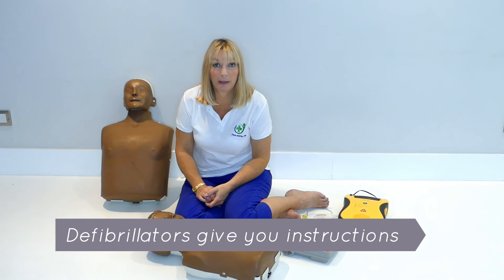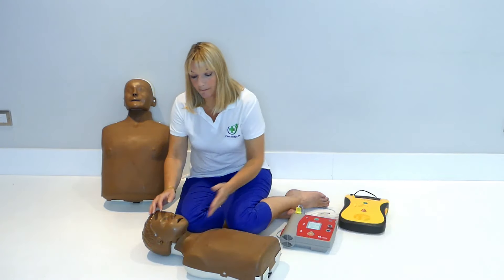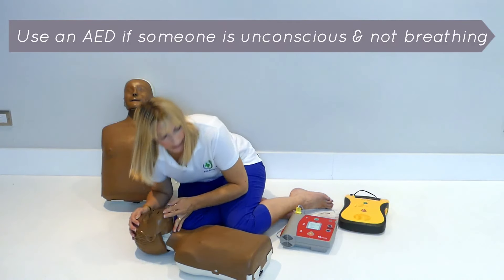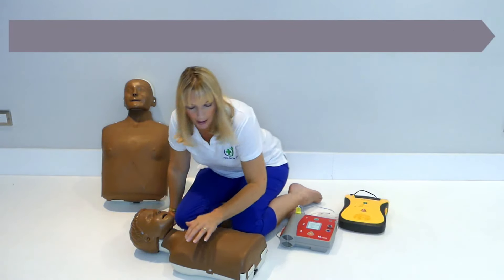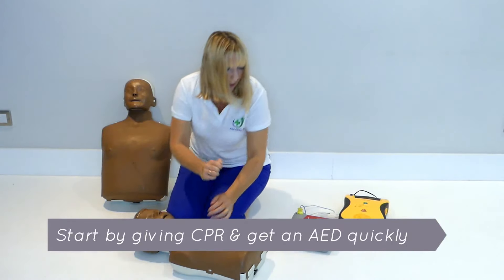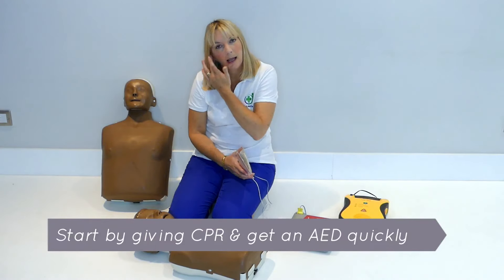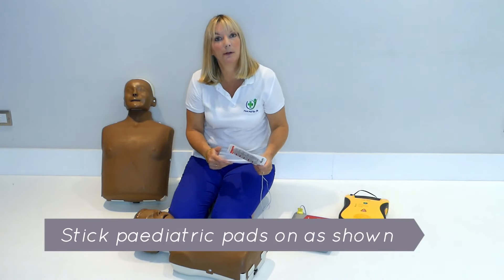Using a defibrillator is incredibly easy — it speaks to you. You use a defibrillator if you have someone who is unconscious and not breathing. For a child, you would start with five breaths and then do the chest compressions, then get the defibrillator as quickly as you can, and you would peel off the pads and stick them on the chest as shown.